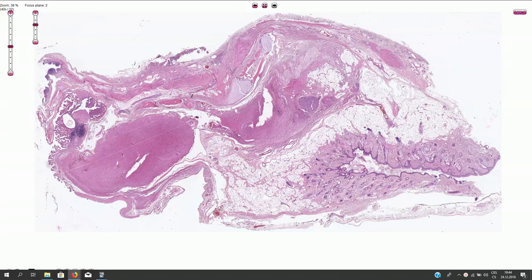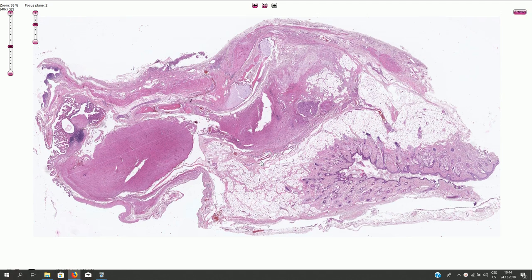This is an example of ovarian mature teratoma. It is a mature germ cell tumor which is often composed of structures from all three germ cell layers: ectoderm, mesoderm, and endoderm. It is a very common ovarian tumor, and if it is mature and not associated with malignant transformation of one of the components, then it is considered to be benign.